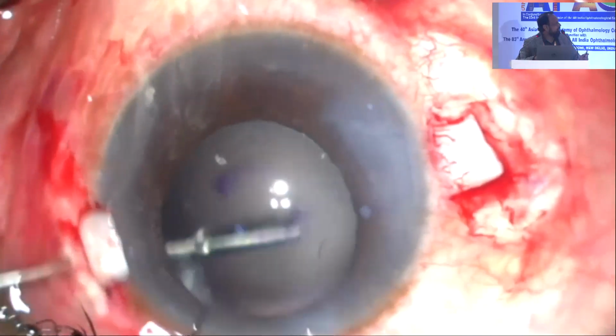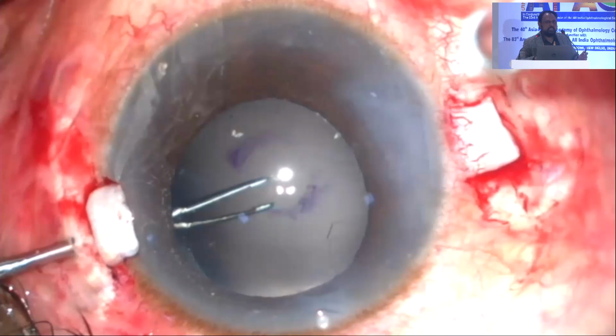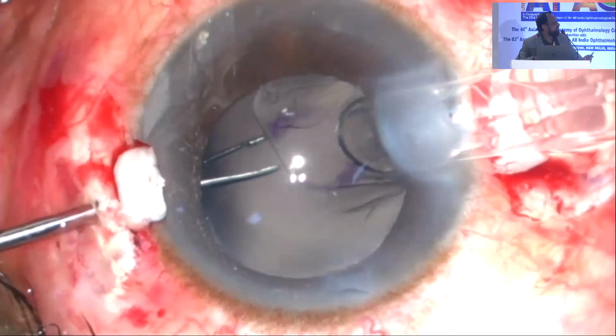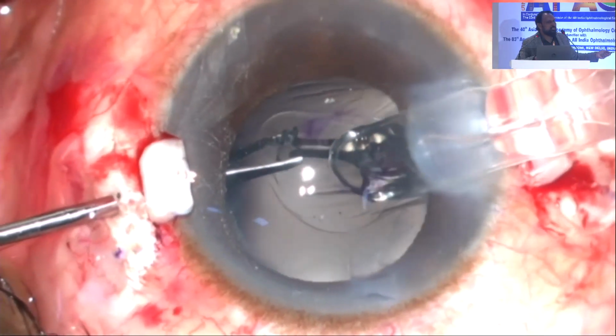that go through the sclerostomy. The other advantage of these lenses being foldable is that you can make your corneal incisions wherever you want, diagonally opposite. So this makes it easier to feed the lens. Initially we were always doing superior, but then you have an angle of 90 degrees that has to be negotiated, so this way it makes it easier. So make sure that the T haptic comes out first, so it is easy to grasp it.